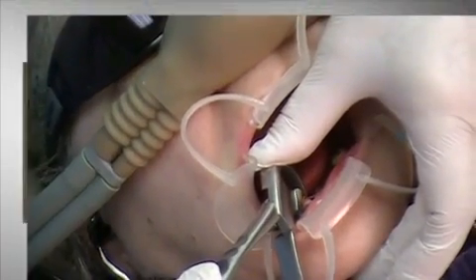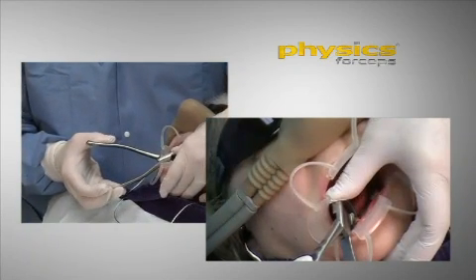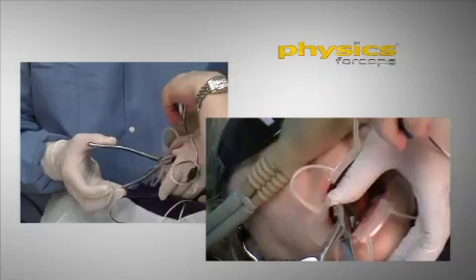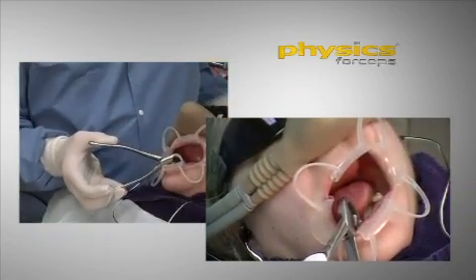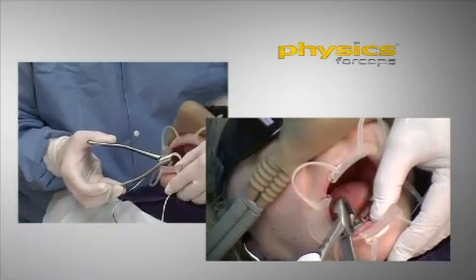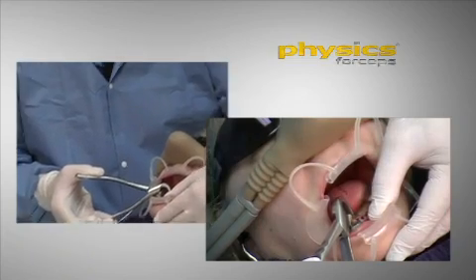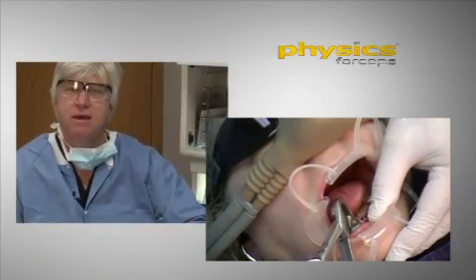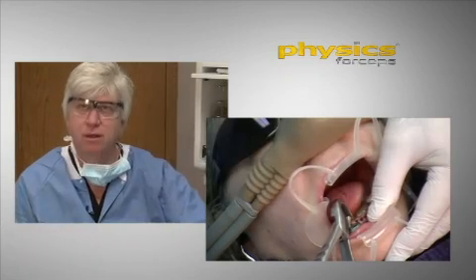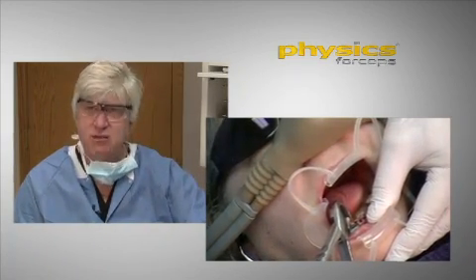And simply rotating my wrist, rotating my wrist slowly — and it may take a minute or two. You just have to take your time. It's not a typical forcep that you're using force with; it is very atypical, and you're using leverage to remove the tooth.